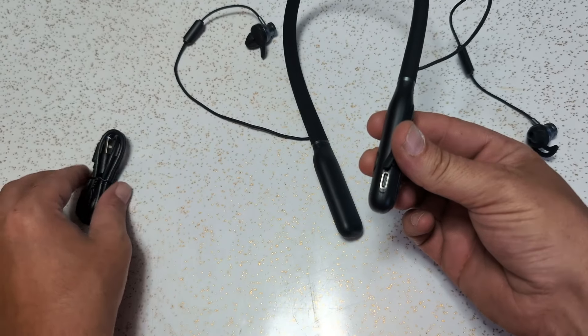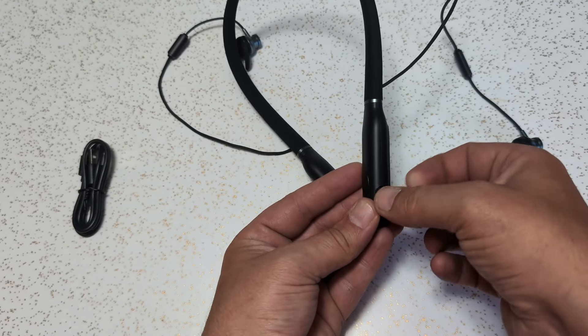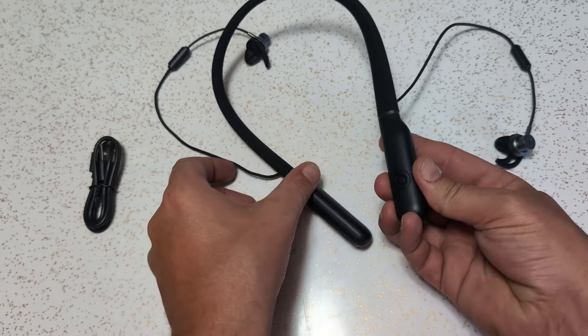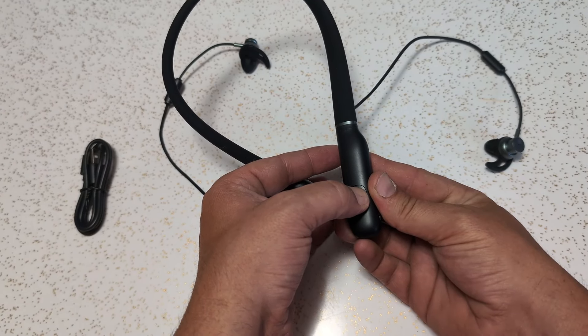And if you have them turned up, it's going to yell into your ears, which is great if you're really, really hard of hearing — you're going to know that the battery is low. But if you have some hearing and you're using these to amplify sounds, it's really loud. So just make sure you don't let the battery get low.